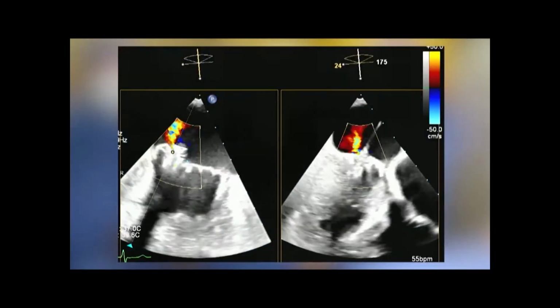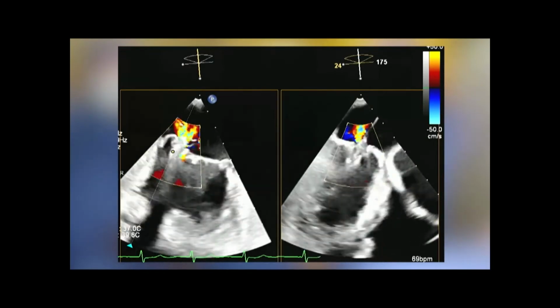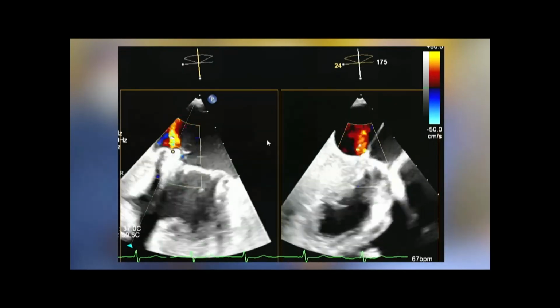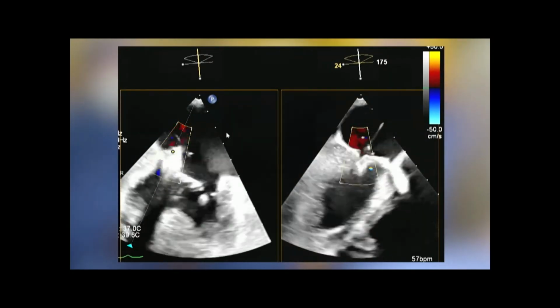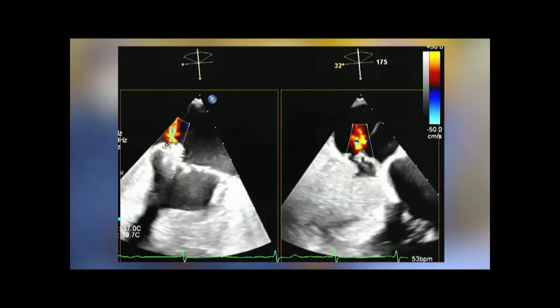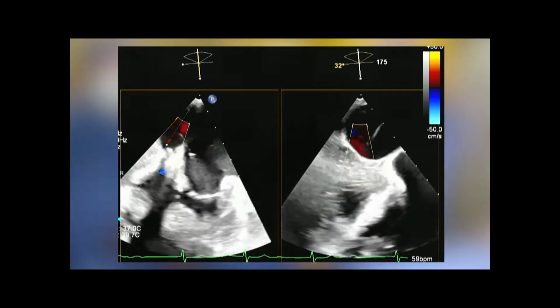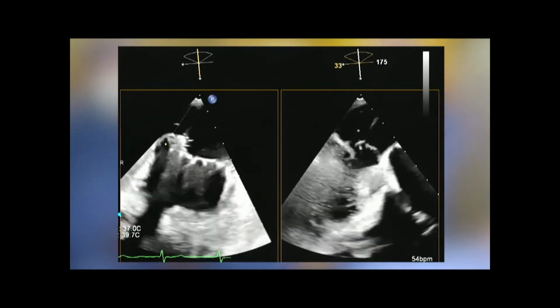There's at least a little bit of prolapse tissue still. Yeah. Medially, right? In the medial part. Yeah. Can we cursor even more medial, please? Yes. For this, I have to make the color even smaller. There's no PISA. Tiny bit. There we see we have a bit of there. There's a little bit. Prolapse, but there's no PISA below the leaflets.